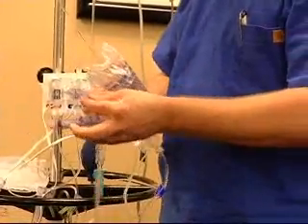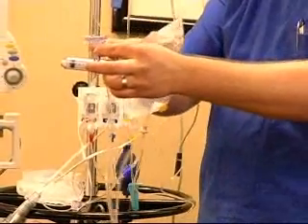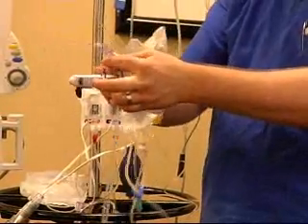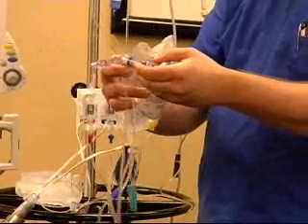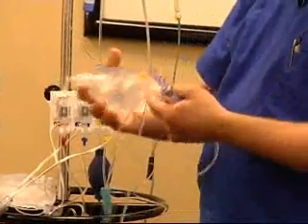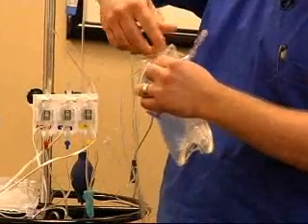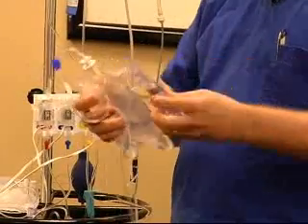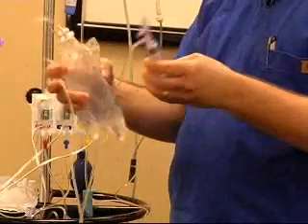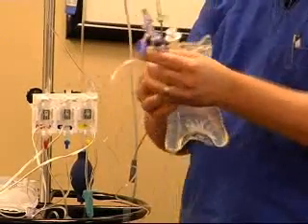If you look at this, there's the valve right there, and this connects to your patient side. The side that has the connector for the cardiac output, that's the one that goes over here. The syringe goes on the other side of that, okay? So you're going to thread that on and let the rest of the air out of this bag. If the clamp happens to be clamped, it doesn't come that way, but if you can't figure out why your system's not pulling back, it's probably clamped, okay?